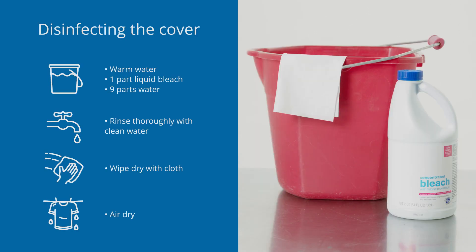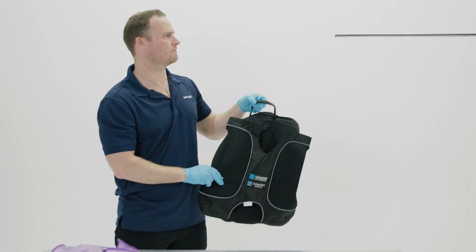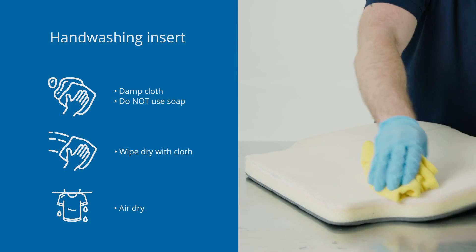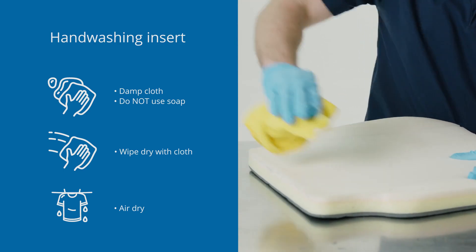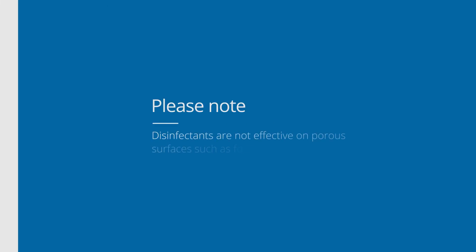To disinfect the cover after cleaning, hand wash in warm water using one part household bleach per nine parts warm water. Rinse thoroughly with clean water and allow to air dry completely before use. For cleaning the support foam inserts, wipe lightly with a damp cloth, making sure not to use soap. Wipe the inserts off with a clean cloth and allow to air dry flat completely. Please note that disinfectants are not effective on porous surfaces such as foam.